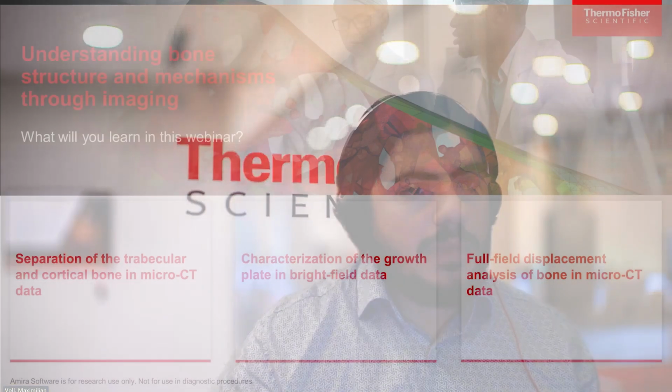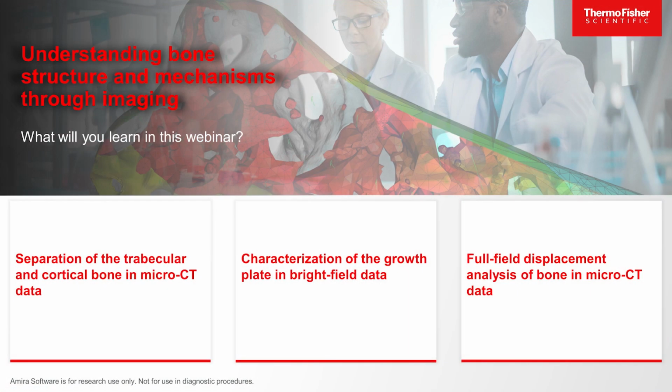So from my side, today we will revisit the three use cases which have been introduced during the introductory webinar already. Our goal is to show you how Amira Software supports researchers to understand the bone structure and physiology. So today we will talk and demonstrate the separation of the trabecular and cortical bone segments in microCT data.